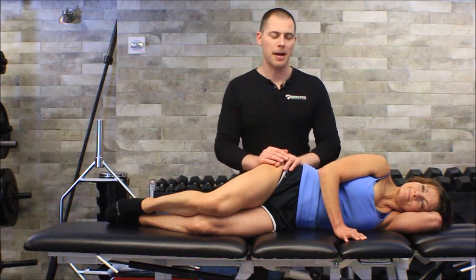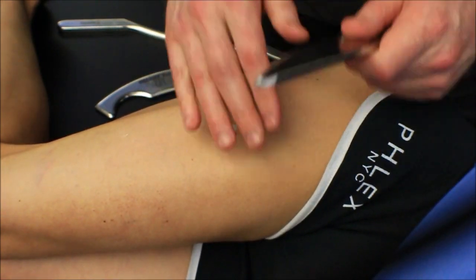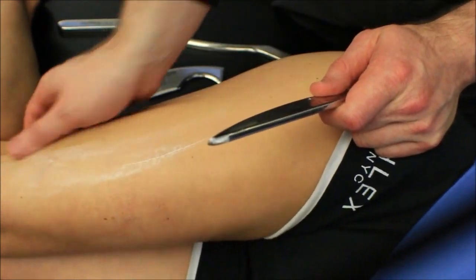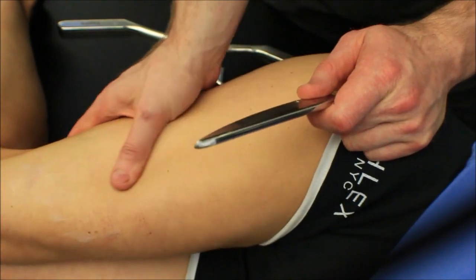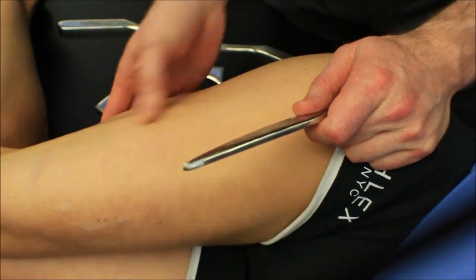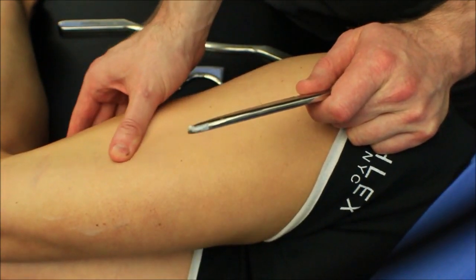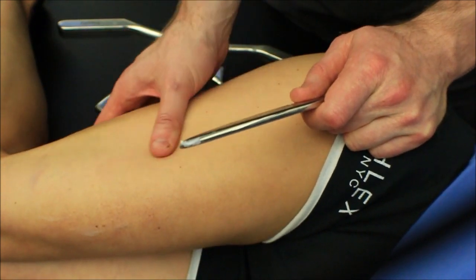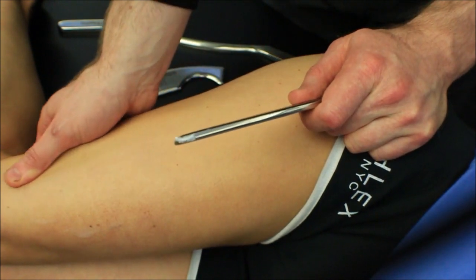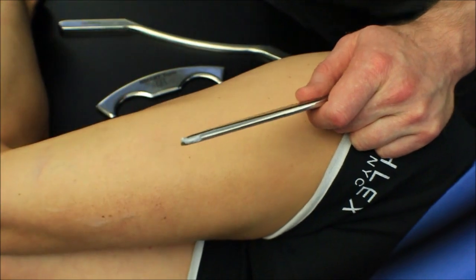Now for your close-up recap: I'm going to use a little bit of this Smart Tools cream to get some lubricant on the skin so we don't abrade it. Again just feeling through, picking up as much information as I can — she's definitely got a little more density here and closer down to her knee. I can feel the iliotibial band right here too, and as we mentioned, we're not going to attack the iliotibial band. I've never found any good outcomes, but I have noticed it will cause a lot of pain and bruising if you go after it aggressively.